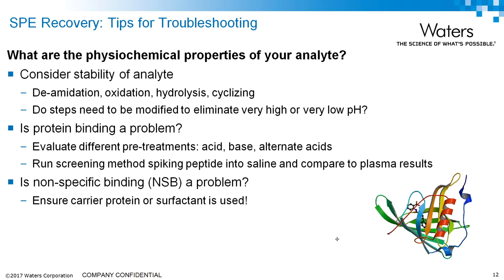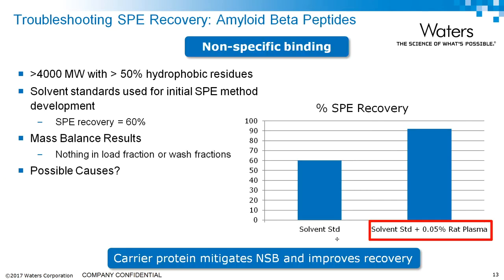Protein binding was discussed earlier as a significant issue. Things to consider include acids, bases, strong acids, and denaturants such as guanidine hydrochloride or urea. A quick way to determine if you have a protein binding problem is to compare recovery in a saline solution with carrier protein to a plasma solution — if recovery is lower in plasma, you likely have a protein binding problem. For nonspecific binding, always ensure you use carrier protein.